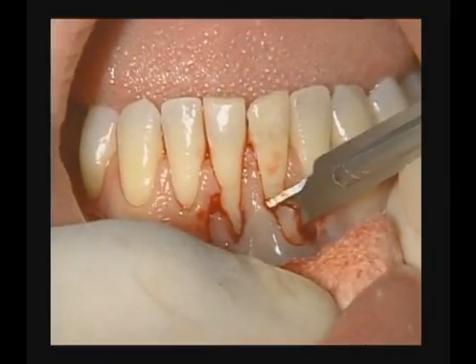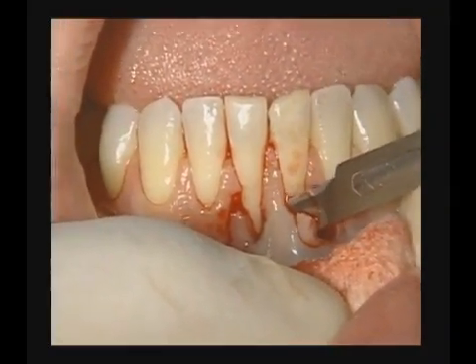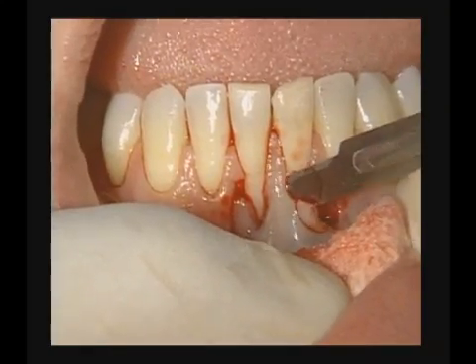So we're raising the flap from the patient's left side and extending under the papilla.